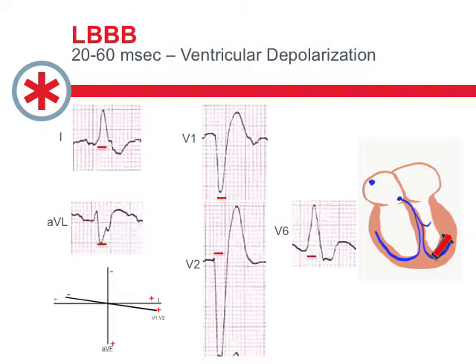All right, so the next step, of course, is really the big depolarization, and although the right ventricle is somewhat depolarized, it is now leaking into the left ventricle, which of course is much thicker, much more massive, and really then is going to influence the amount of current that's flowing in the heart. So the sort of 20 to 60 millisecond part of our QRS complex is really reflective a lot more of left ventricular depolarization. But of course, it's depolarizing in a bit of a weird way because it's coming over from that right ventricle and from the interventricular septum.